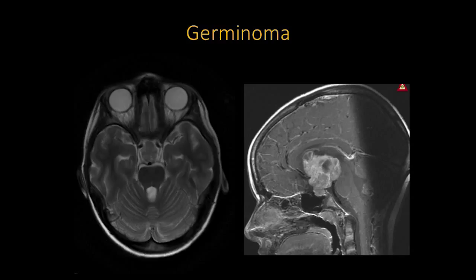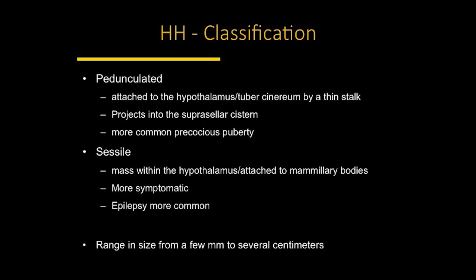Another patient: axial T2 MRI shows the brainstem, basilar artery, carotid arteries, and optic nerves entering the orbits, with a lesion in the suprasellar cistern — could easily appear to be a hypothalamic hamartoma. However, the sagittal post-contrast imaging shows the lesion is large, involves the sellar region, and has extensive enhancement within it — clearly not a hypothalamic hamartoma. This was a germinoma, a germ cell tumor treated completely differently, with different symptomatology as well.